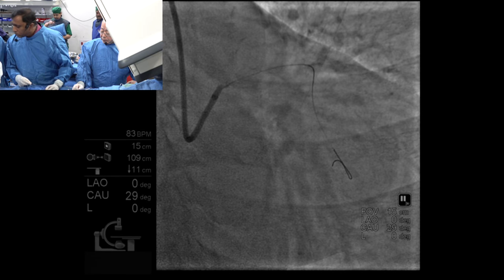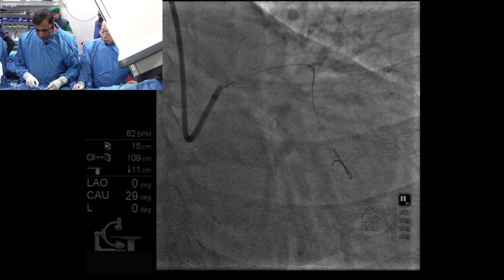I don't stock Miracle wires. I use the wires. Okay. No longer using Miracle and Conquest Pro. No, I use the wires I just mentioned.